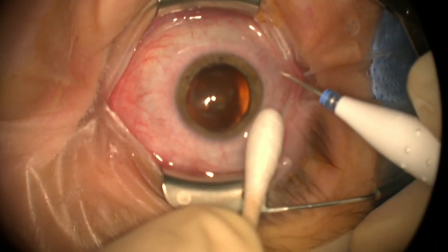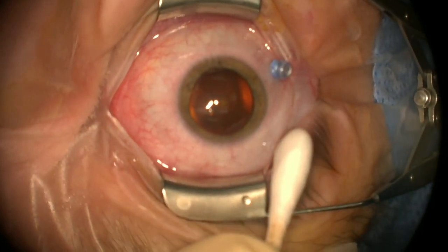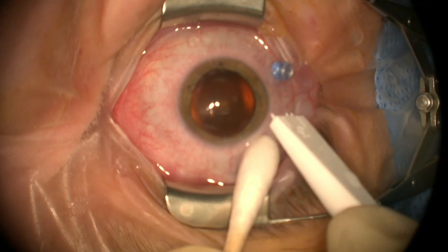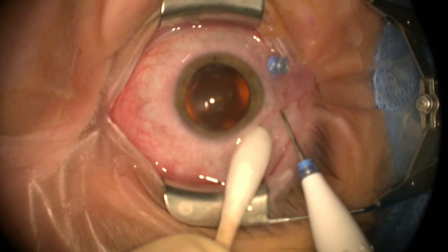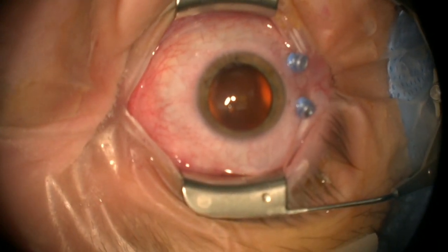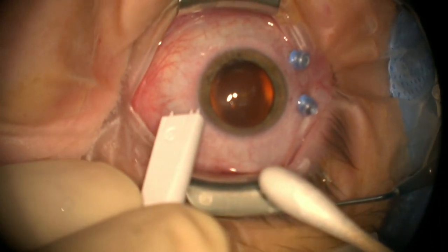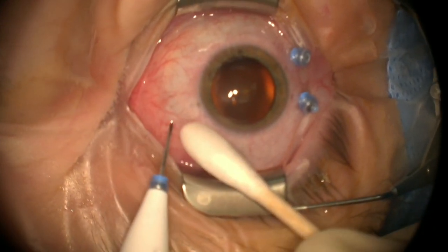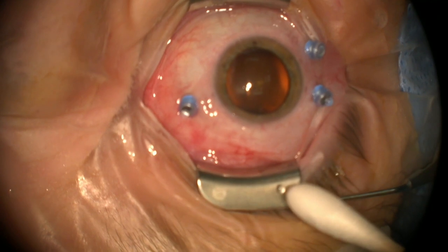And we'll look to put an incision right there. I like to make these wounds kind of long and straight going through the conjunctiva, and I like to make them near the horizontal. Displace the conjunctiva again, but again, I like the wounds to be kind of long and straight, and the cannula is kind of pointed towards me. The reason we do that is for wound closure at the end of the case. It's kind of nice to have the cannulas oriented towards me. A nice long scleral tunnel is easier to collapse at the end of the case.